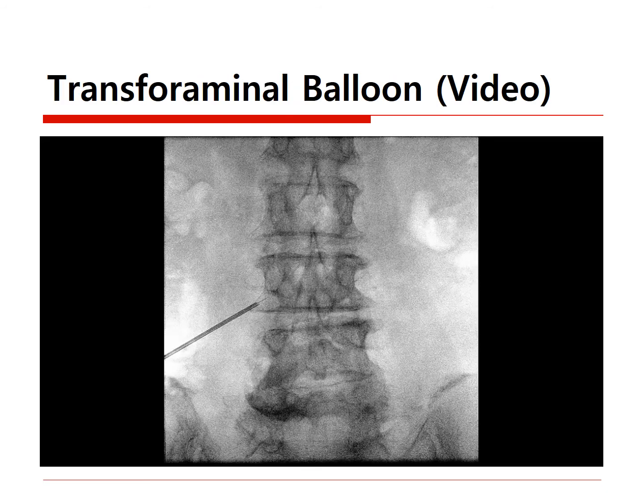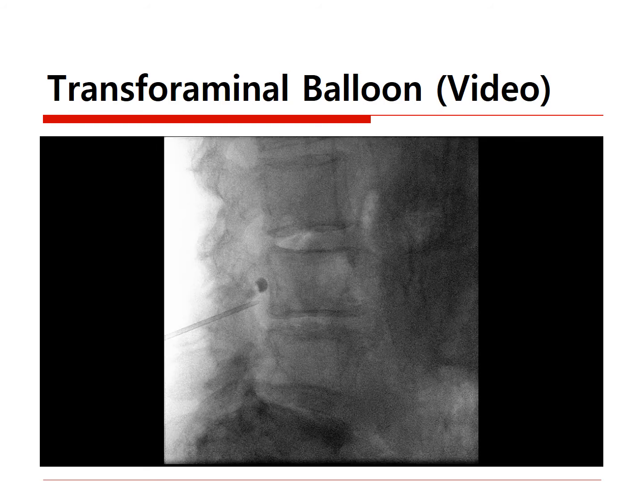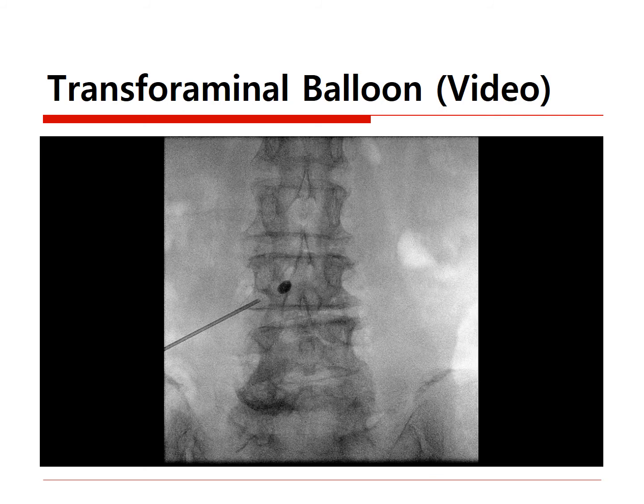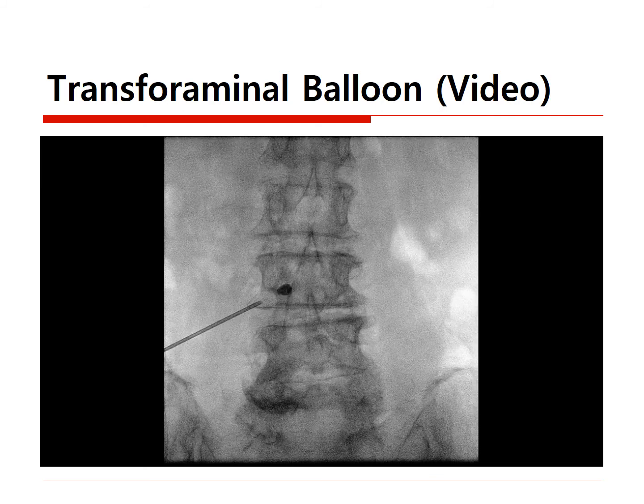A transforaminal approach is also possible using a specially designed balloon catheter. This video shows neuroplasty using a transforaminal balloon.